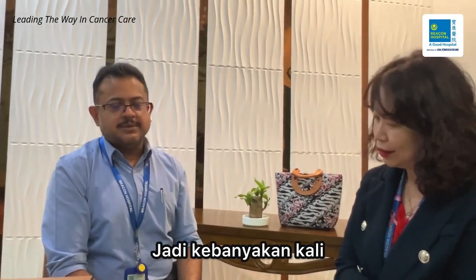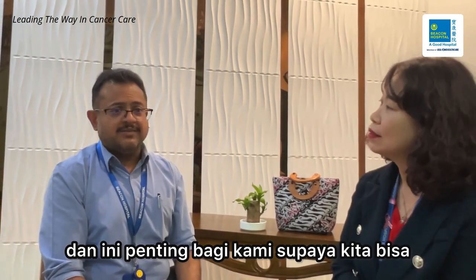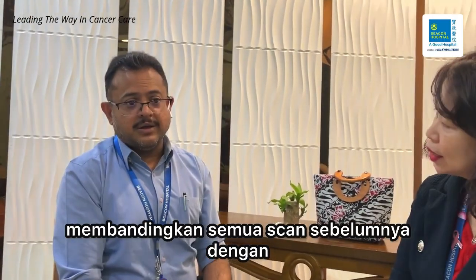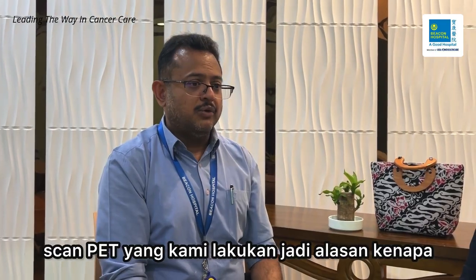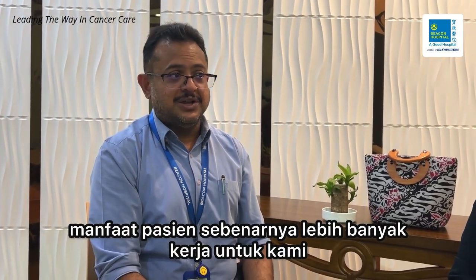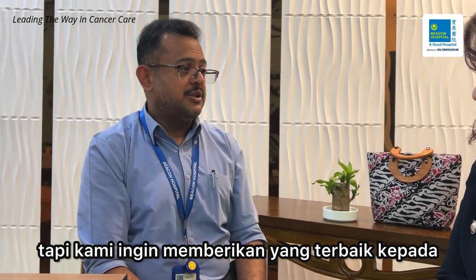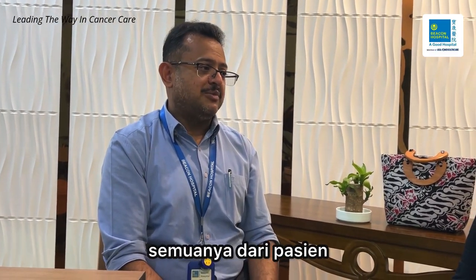Most of the time, these patients would have had MRI scans, ultrasound scans done elsewhere, and these are important for us so that we can compare all the previous scans with the PET scan that we are doing. The reason why we ask for all this information is for the benefit of the patient. Actually, it's more work for us, but we want to give the best to the patient. So that is the reason why we request everything from the patient.